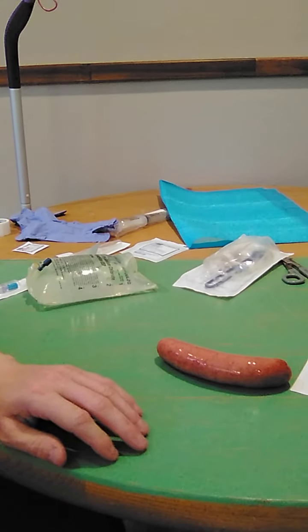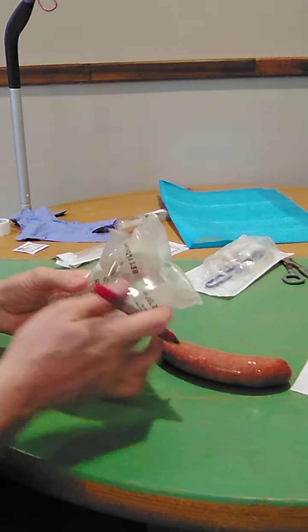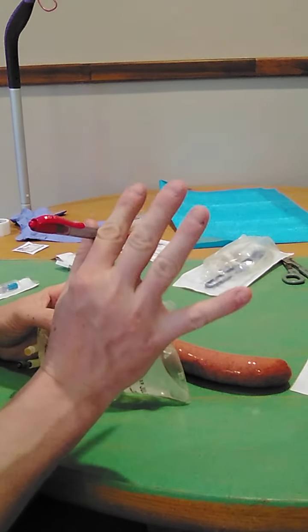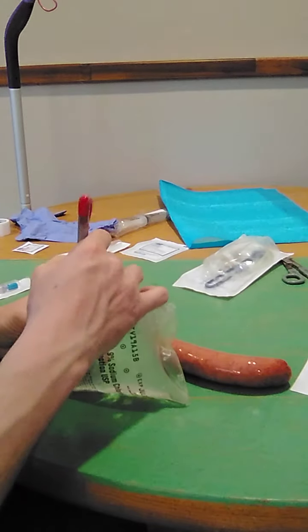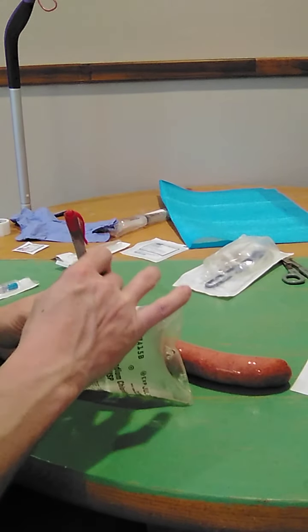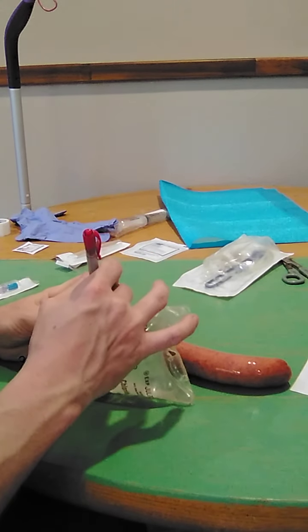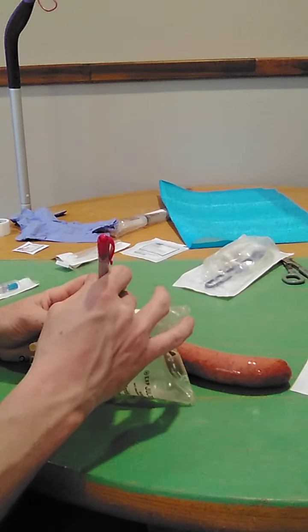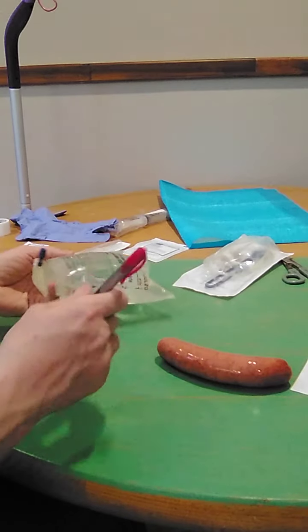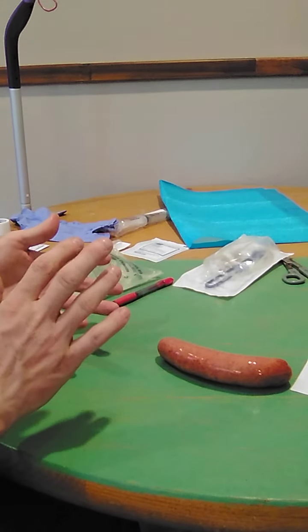So firstly, we're going to start beginning our record keeping. I'm going to label this bag with the patient's name, their date of birth, today's date being 4/12 of 2020, the registered nurse administering this medication, the time that the infusion begins, leaving a space for when this infusion will be ended, as well as the rate of infusion that is specified in the prescriber's order and the medication administration record.